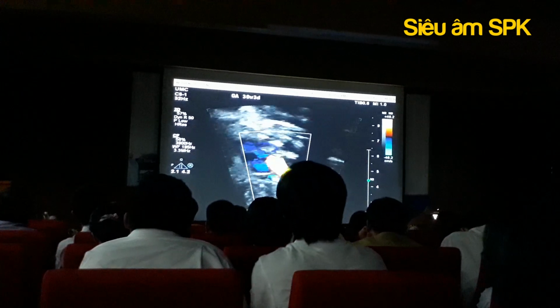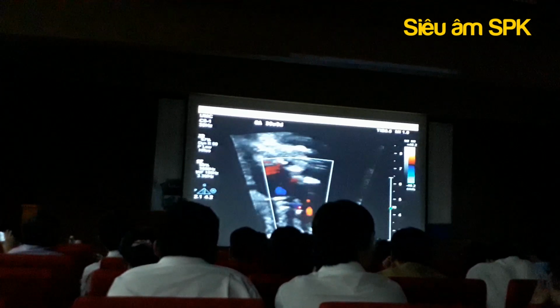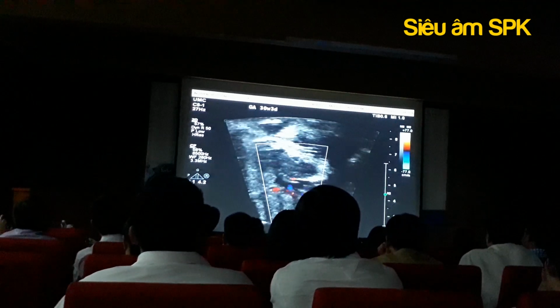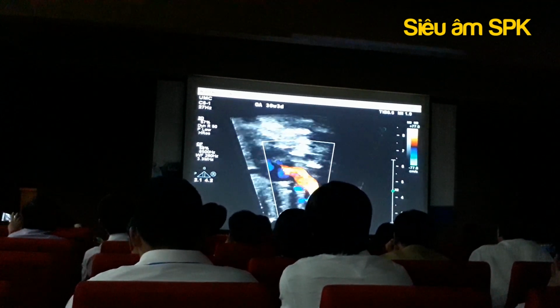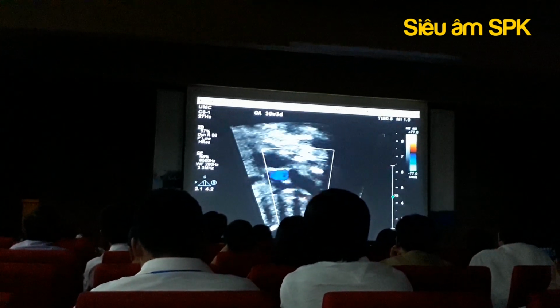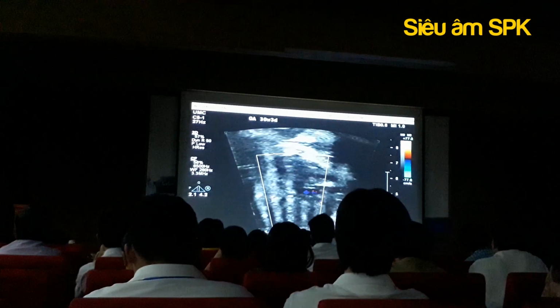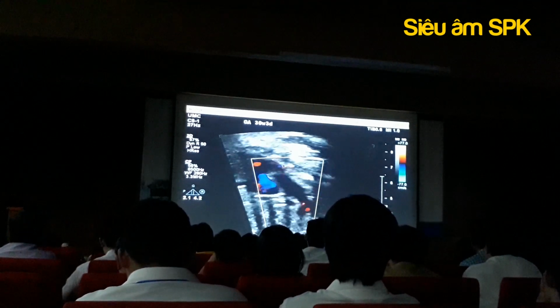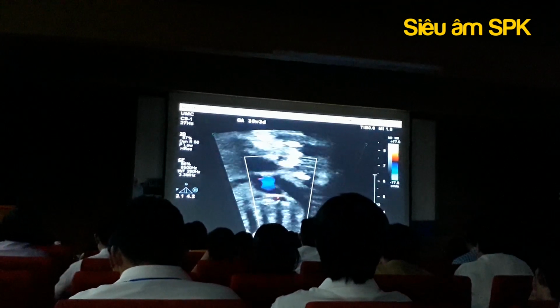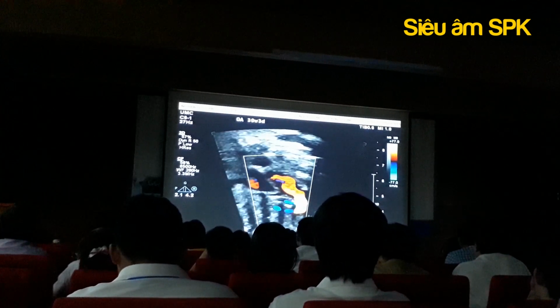Reorient the picture. And now it looks pretty obvious that there is a ductus coming from the underside of the arch. This is the ductus arteriosus. That's retrograde and filling that right pulmonary artery. Very clear. Do we see that? Yeah. Right there.